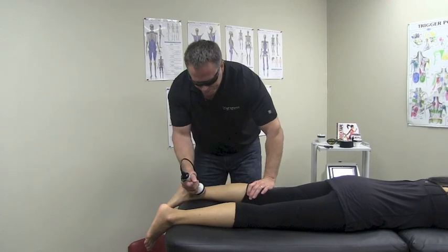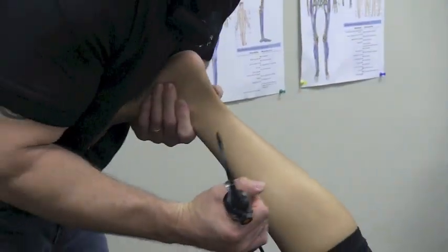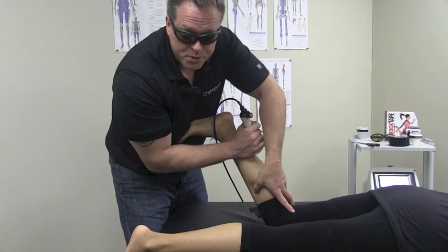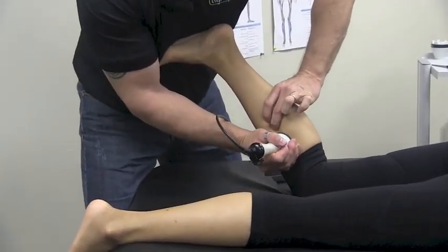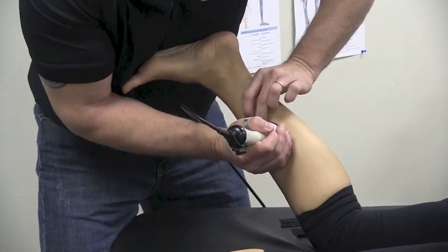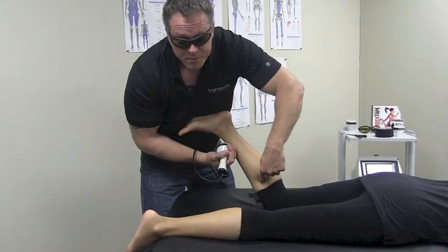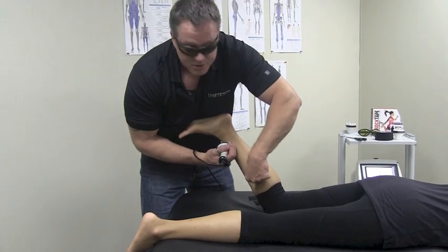Then I'll come up into this region, applying more pressure. I'm going to lift up, support and hold — notice I can do two at once — and really control the tissue depth. When working close to the shin, I'll take the ball and move right along that area, using my other hand as a guide point and getting feedback from the patient. If you find an area where you feel an adhesion or a knot, focus there and rub it a little harder, then move on. This area is extremely tender where the fascia attaches to the bone, and that's where the laser comes into play to reach that deep fascia that you can't reach superficially.